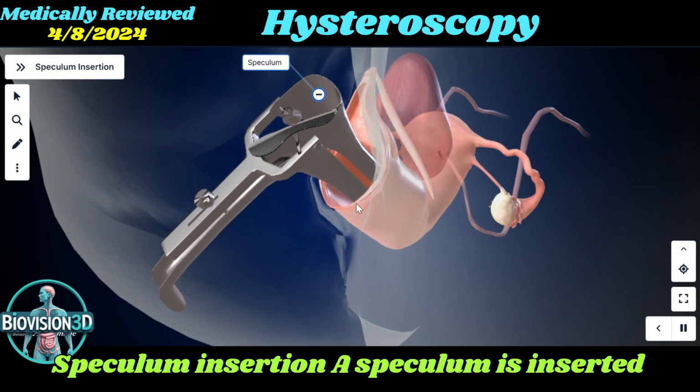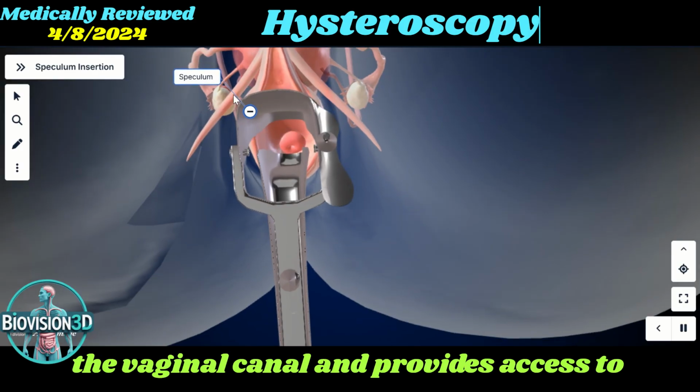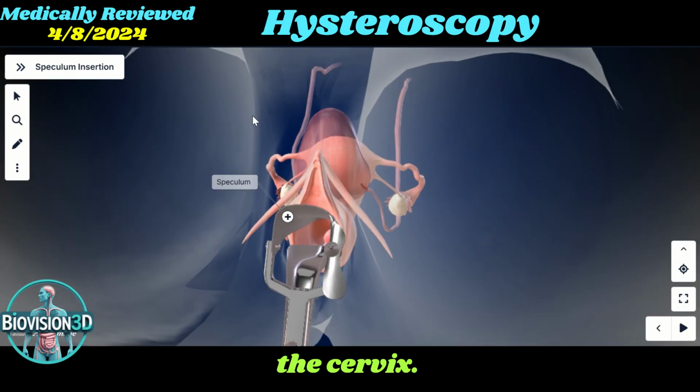Speculum insertion. A speculum is inserted into the vagina, a device that widens the vaginal canal and provides access to the cervix.